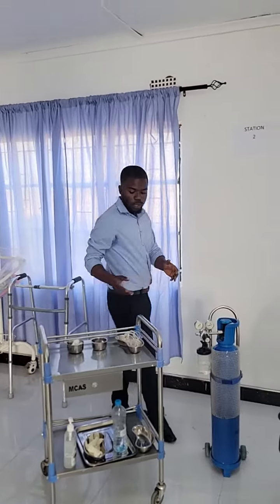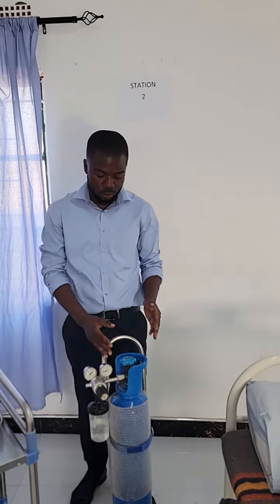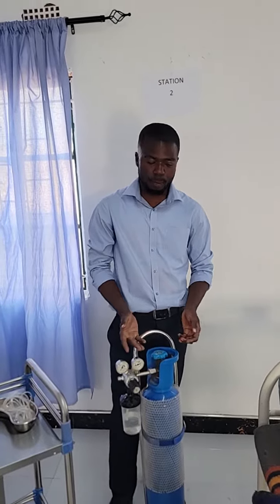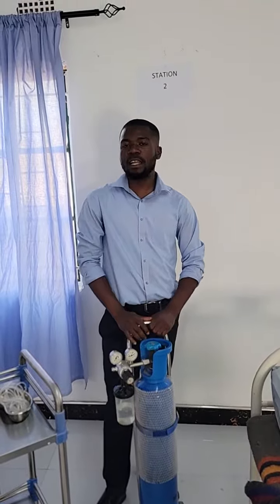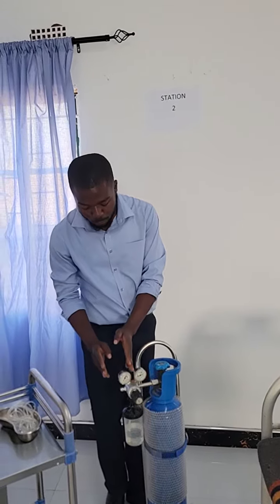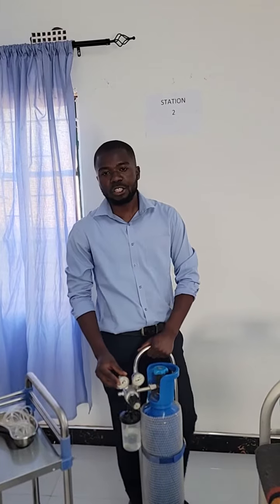So now, we have the trolley this side, we have the cylinder, and the patient this side. Let me just introduce the parts of the cylinder. This whole thing is known as a cylinder, but it's got parts. This part is known as the cylinder valve, this blue thing. Then we have the pressure gauge, and another thing which looks similar to the pressure gauge, which is known as the flow gauge.